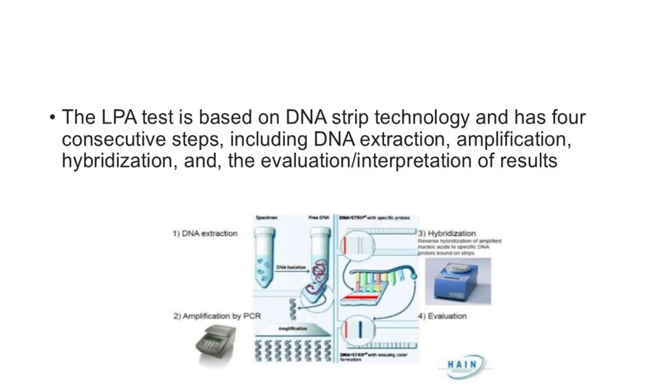Now you look at the LPA report. It's an open system. You have to extract the DNA, then you have to amplify, hybridization is done, and then evaluation or interpretation. So there's a lot of chance that cross-contamination will occur. And usually in the program that we are doing, we don't do LPA directly, we are doing it on a culture. So already there are subcultures of these organisms.